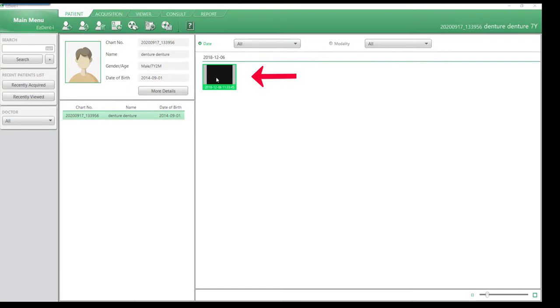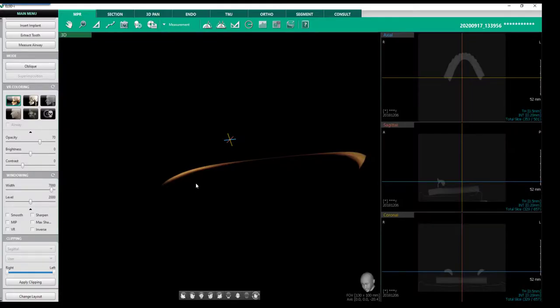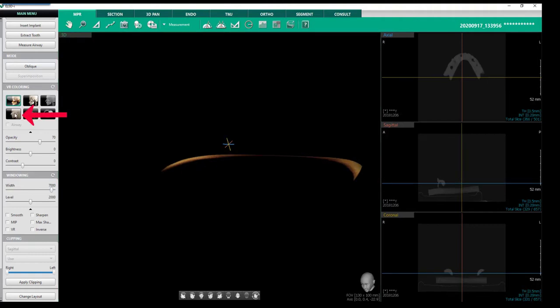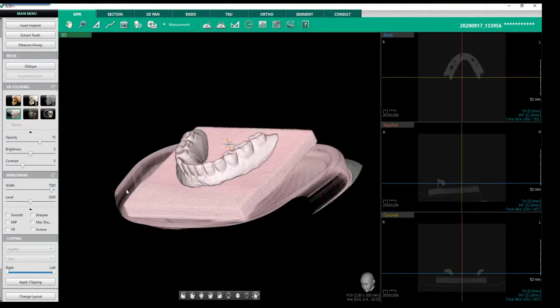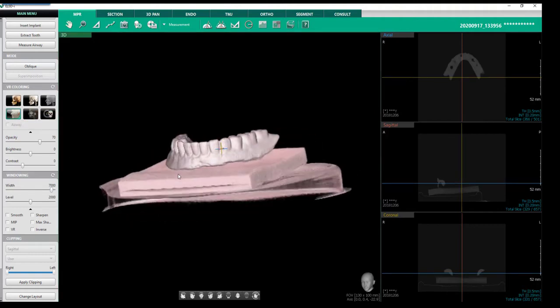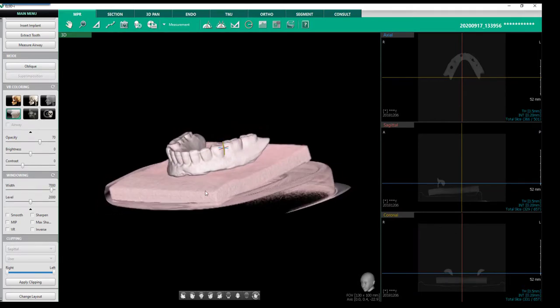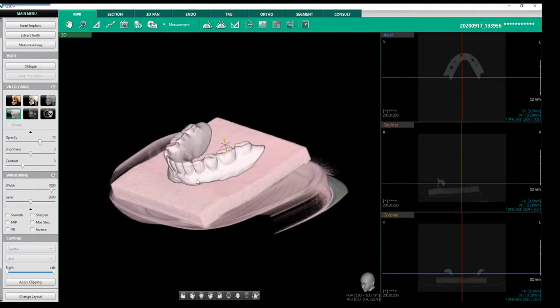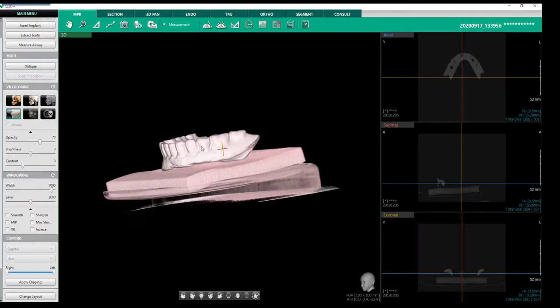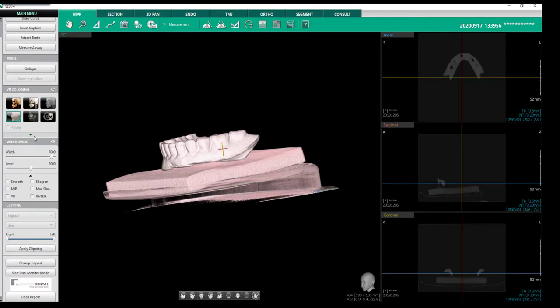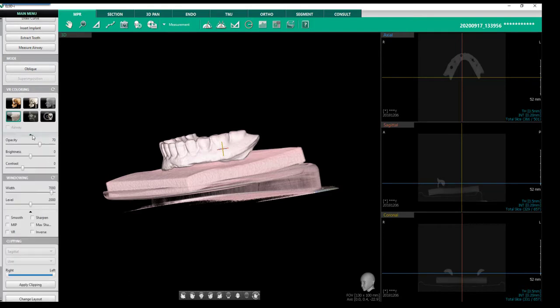Double-click on the CBCT icon to open the Easy3D Eye software. On the left toolbar, VR Coloring, select Soft Tissue. This will change the density to better visualize the scanned object. Utilize the opacity slide bar to adjust the image opacity.